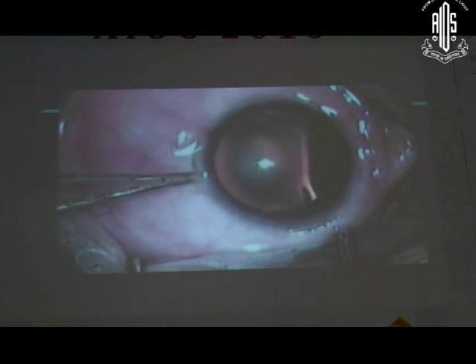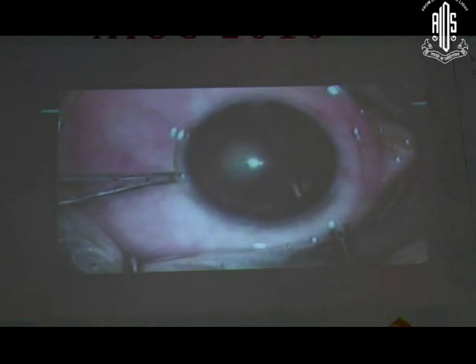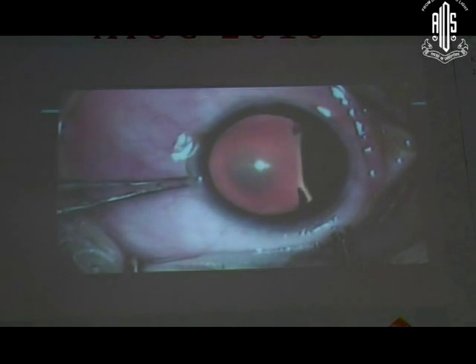So I am showing this case. This is a 24-year-old male with a traumatic subluxation there. There was phacodonesis, and you can actually see the area of subluxation which is extending up to 4 clock hours there. We've made 3 paracenteses which are slightly more towards the limbus, and we're using the external fixation of the capsular bag, and these hooks, rather than the iris hooks, are easier to manipulate. These hooks do not pull onto the bag in a similar way and are less sharp, and hence the chances of a tear, as Dr. Purinder was saying, is rare there, but it's still rarer here.